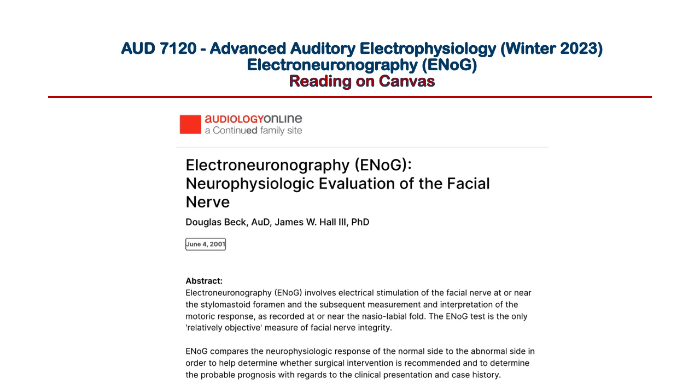It's a very short article, so I would encourage you to read this article as well as the review of ENoG in chapter 17. And then as we get into this lecture, we talk about some of the topics related to ENoG. I'm going to reference several other articles that have been published usually by otolaryngologists on the topic.